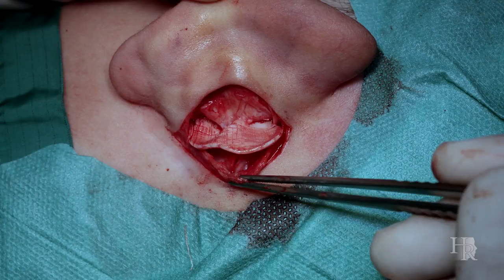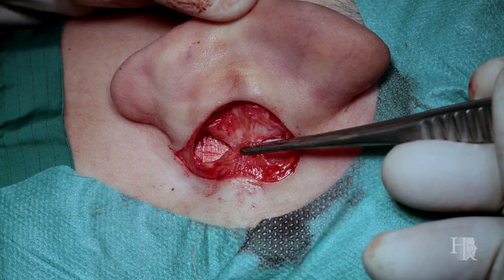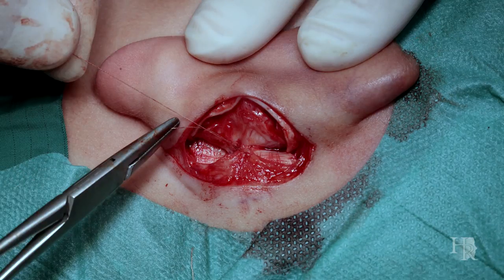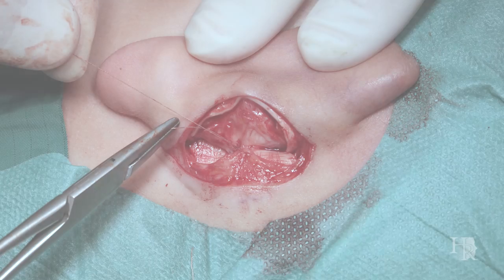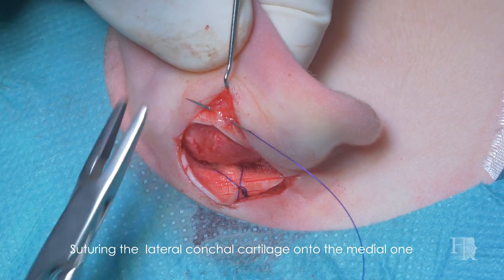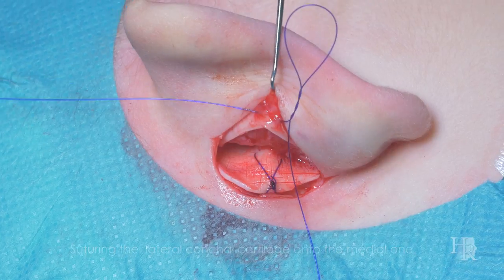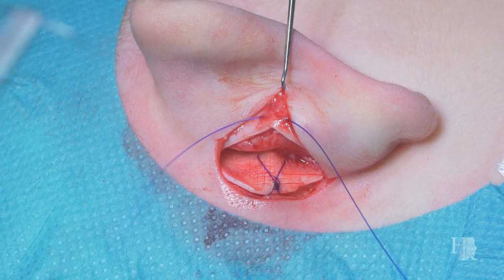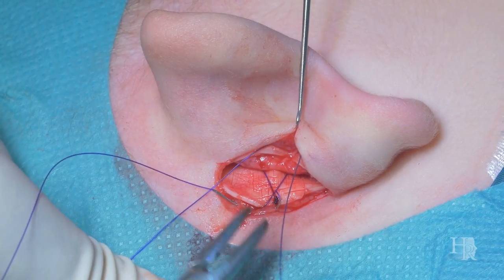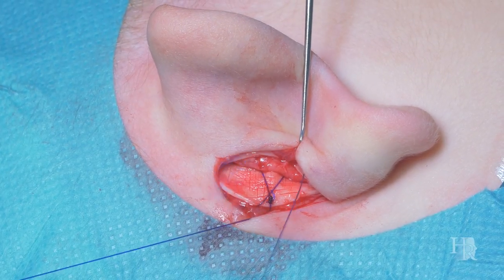Another modification to set back the lateral part of the conchal cavity is to use a soft tissue pocket where you hide the medial part of the conchal cartilage underneath. You can even suture it with a short-term absorbable suture. When you fix the lateral part of the conchal cartilage onto the medial part, make sure that the shape of the auricle is preserved. You should use two sutures — one on the upper part of the medial third and one in the lower part — to make sure that the shape achieves the desired result.